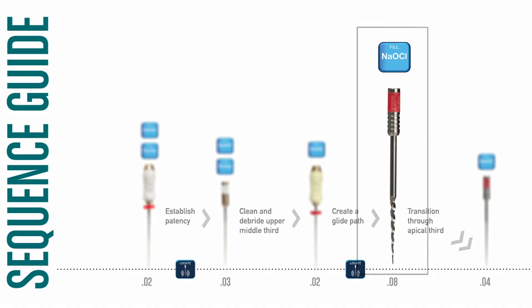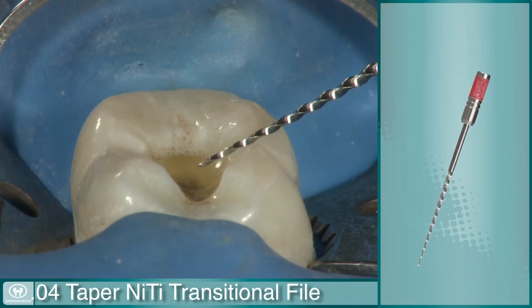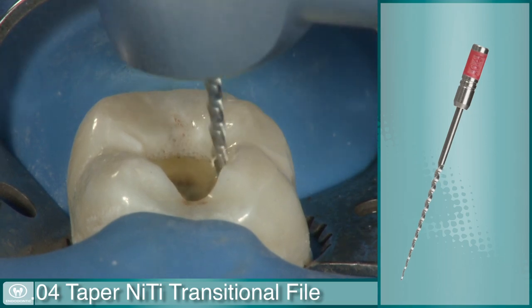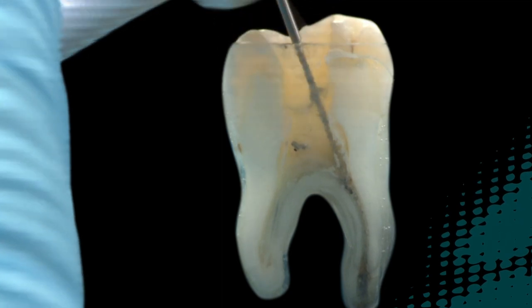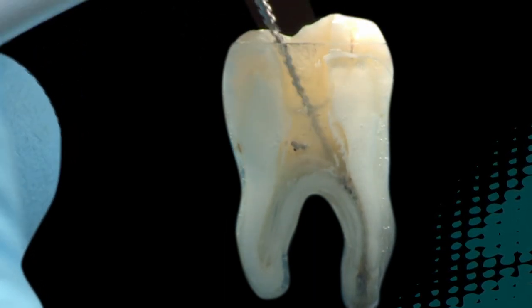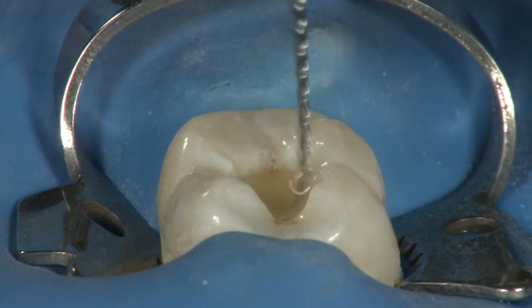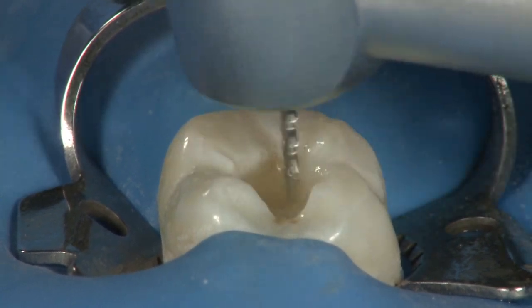The last file on the sequence guide is the .04 taper transitional file. Repeat the previous step using the .04 taper NITI transitional file in the same manner — you should be able to safely reach the full working length with this file. NITI is the alloy used in this portion because it possesses the flexibility required to negotiate curves and reach the apical portion of the canal, especially with larger diameter files. At this point, you will have enlarged the canal to a number 25, .04 taper.